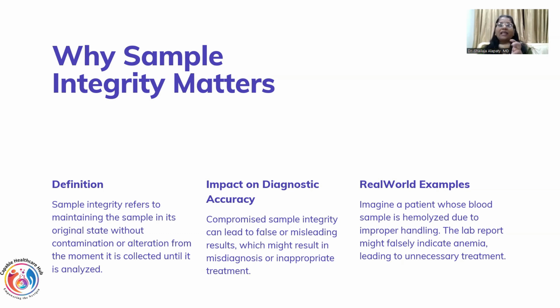Depending on the size of the cell, the machine will detect whether it is RBC, WBC, or platelets. Now, if the cells are lysed, isn't the RBC count going to come down? Have you ever thought about it? That is the crucial part.